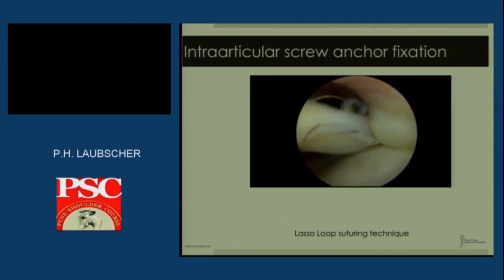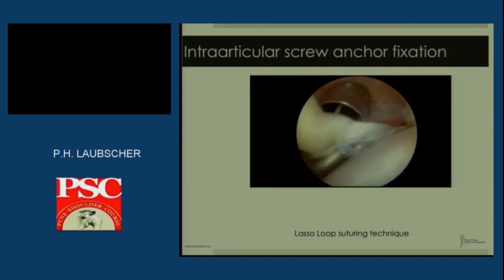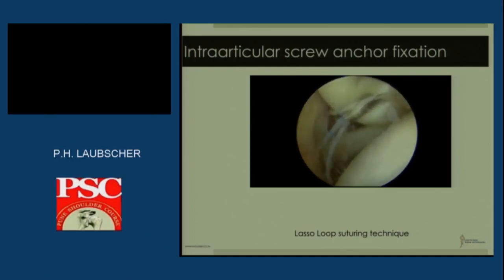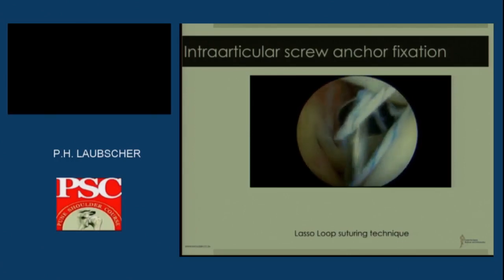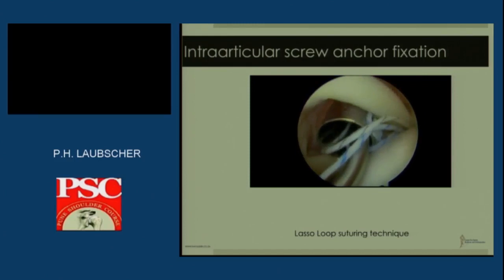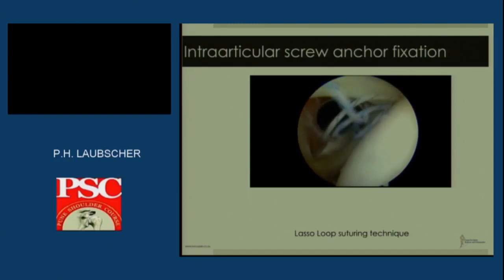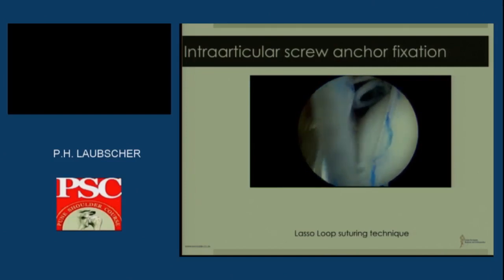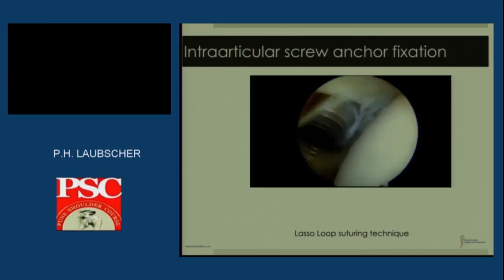If we play this video, once I've prepared my groove and I've inserted my suture anchor, I usually use either a metallic or absorbable screw-in anchor. I then pass the sutures in as Laurent has described, a lasso loop technique to fixate and to hold my biceps tendon. If you were to use a simple suture, you have a risk of a cutout. Now, the reason why I prefer using this type of technique also is I can place my sutures at the site of an anchor.